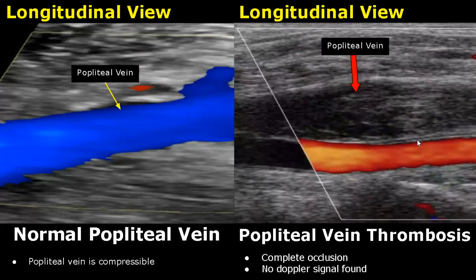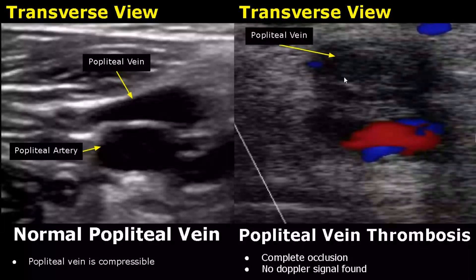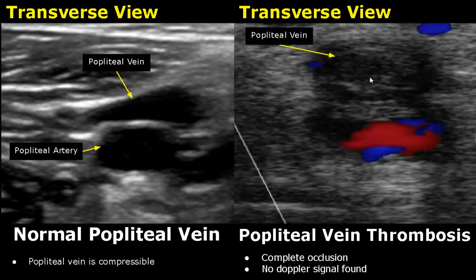Complete occlusion is seen in this image due to thrombosis. There is no Doppler signal found in this selected region of the popliteal vein. Here is a transverse view showing complete occlusion in the popliteal vein — no Doppler signal is found.